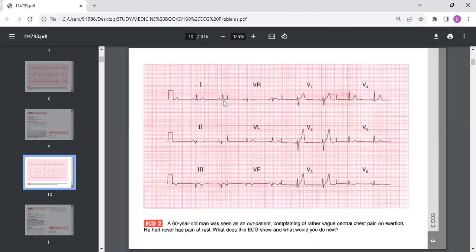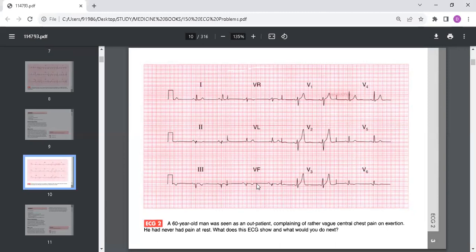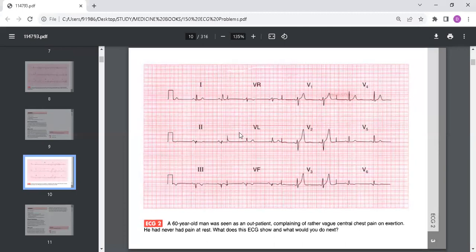This ECG shows sinus rhythm with a rate of around 77 beats per minute, which is normal. The PR interval is normal in all the leads, the axis is normal. There are, however, prominent deep Q waves in leads 2, 3, and aVF which indicates inferior infarction. There are small Q waves in V5 and V6 but these can be septal. The ST segment is fairly normal with no elevation in the leads which are showing Q waves. There are inverted T waves in 2, 3, and aVF.